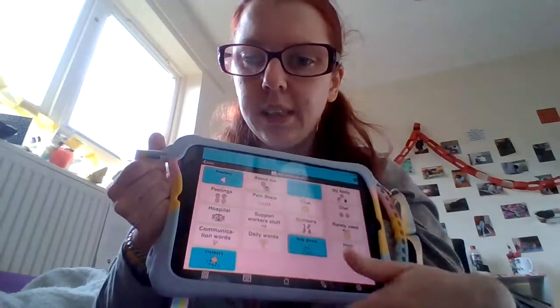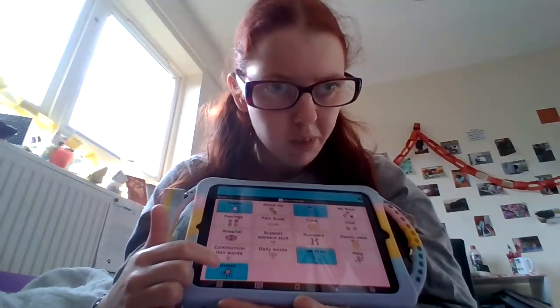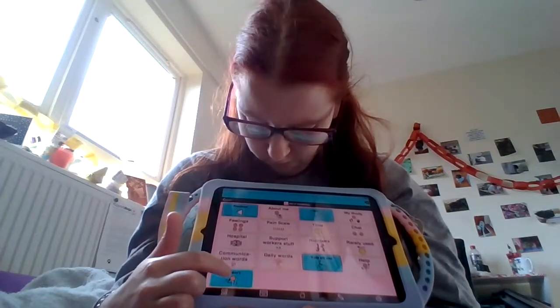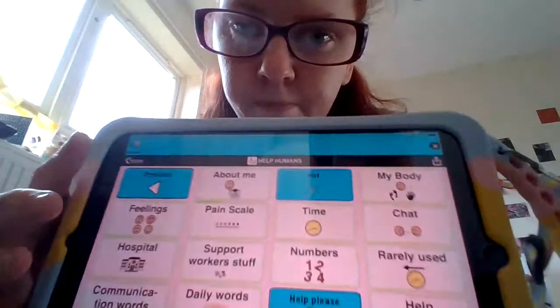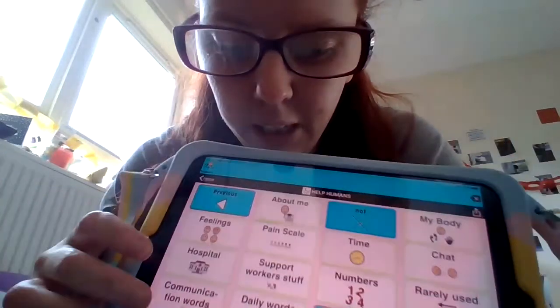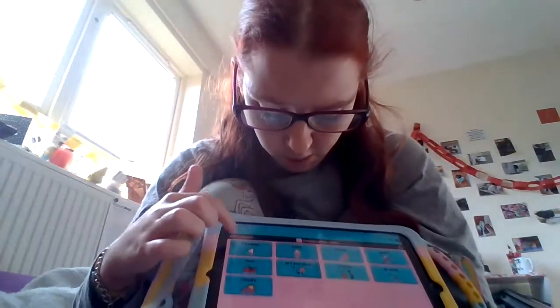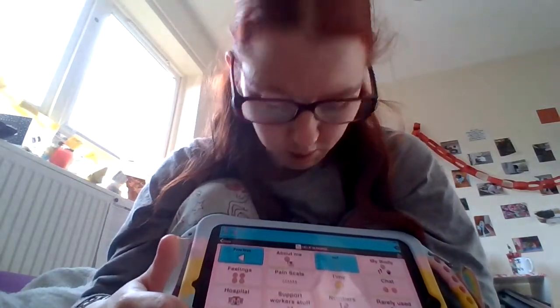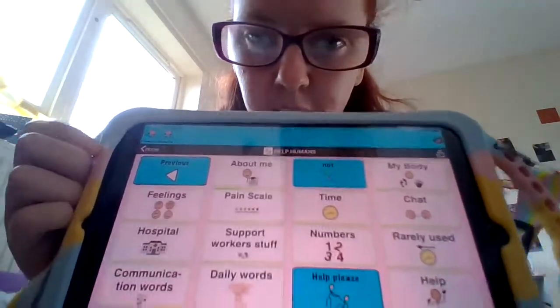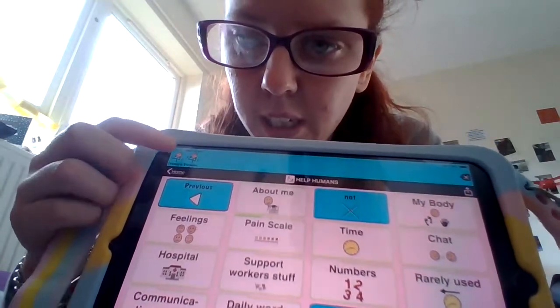But if I wanted to say tremors, I would just click tremors, and then it will appear, should at any rate appear in that. Oh gosh, oh dear. Previous, I'm trying to hold things. There we go. I click tremor and it's appeared in that little corner there, look.